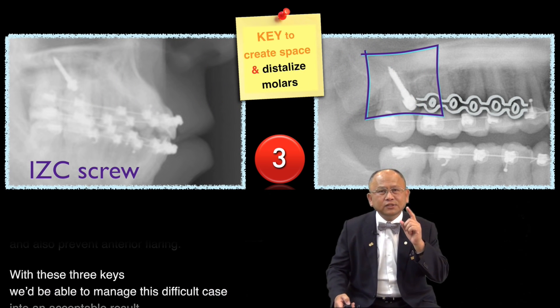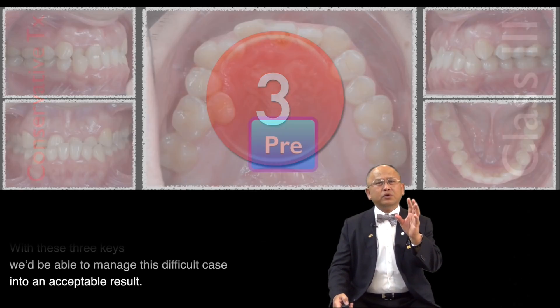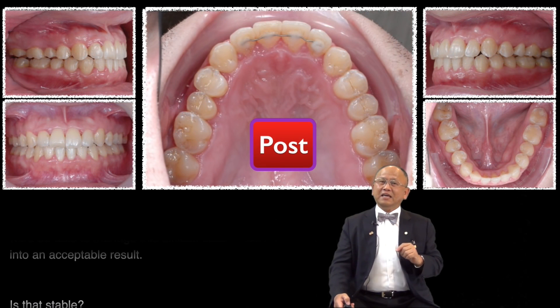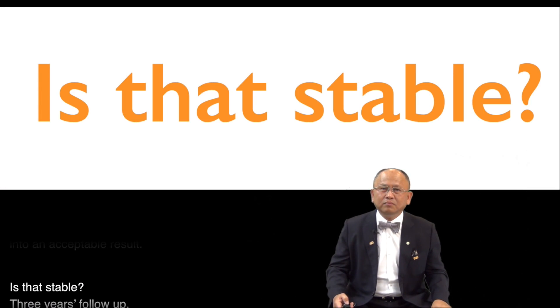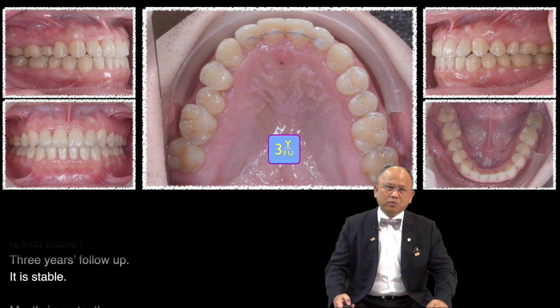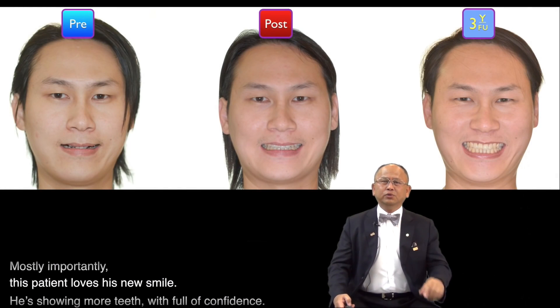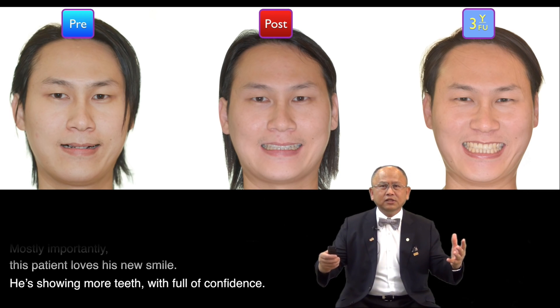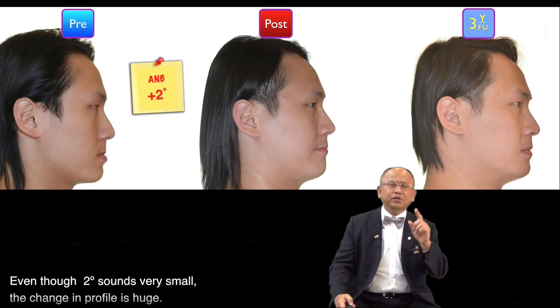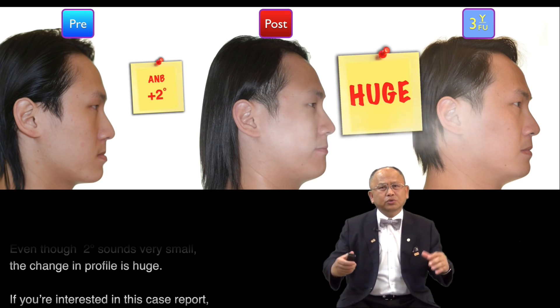With these three keys, we were able to manage this difficult case into an acceptable result. Is that stable? Three years follow-up — it is stable. Most importantly, this patient loved his new smile. He showed more teeth with full of confidence. Even though two degrees sounds very small, the change in profile is huge.